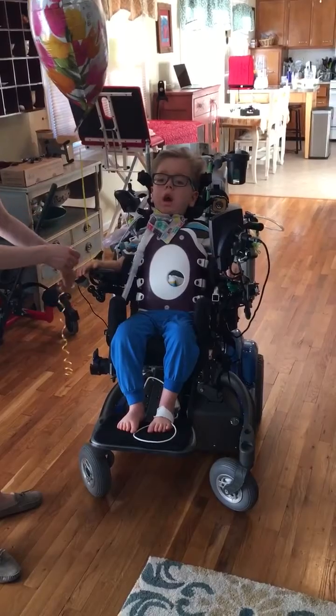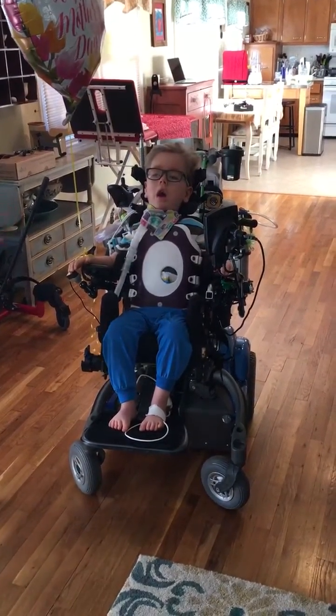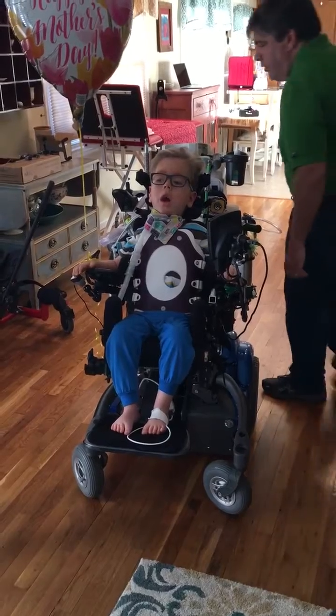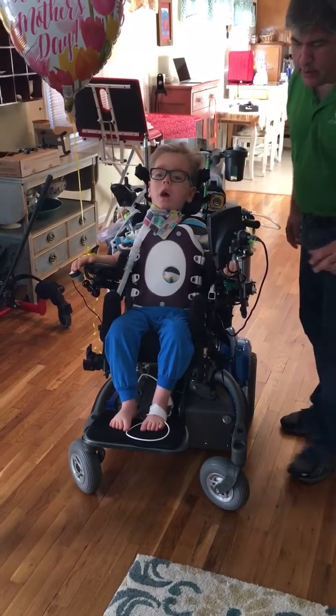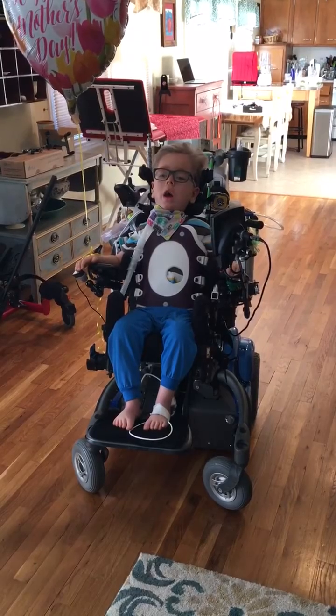Can you turn towards your mom by squeezing that hand? Watch my feet. She's safe, don't worry. This one — come towards me. Is he active? I hear a click. Hold on. It says normal. It does. Let me see here. Okay, now we've got to hold it down and then it'll kick in. Hold down for a quarter second. It was too clicky-clicky fast.